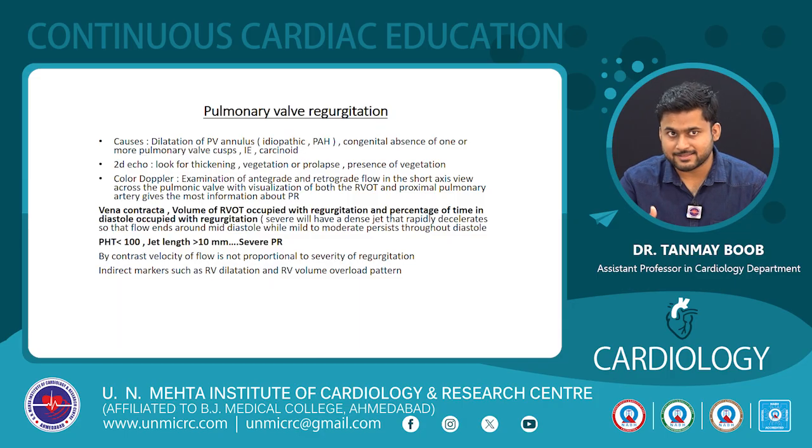Pressure half time less than 100 with a jet length of more than 10 mm, which is 1 cm, will determine severe PR. Severe PR will also have RVOT dilatation, RV and RA dilatation. Velocity of flow is not proportional to severity of regurgitation and should not be used for classifying pulmonary regurgitation severity. Indirect markers will be RV dilatation and RV volume overload pattern.